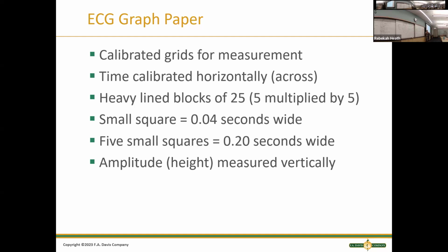Sometimes when we get to measuring, you do want to know that. You want to know these bigger boxes are... oh, I put that wrong. It's 0.2, isn't it? Yeah, it's 0.2 seconds. Am I wrong? Fact check me. Yeah, okay, I can do some math. So the bigger boxes are 0.2 seconds.